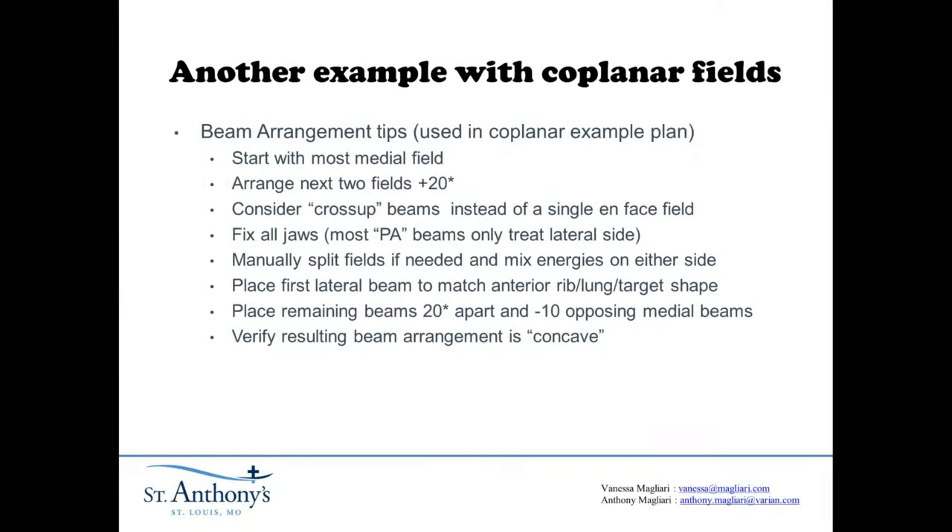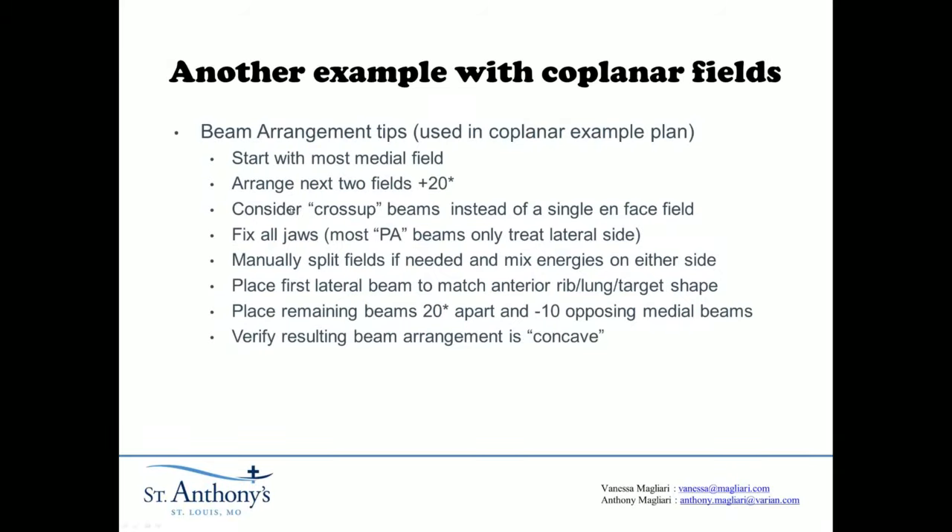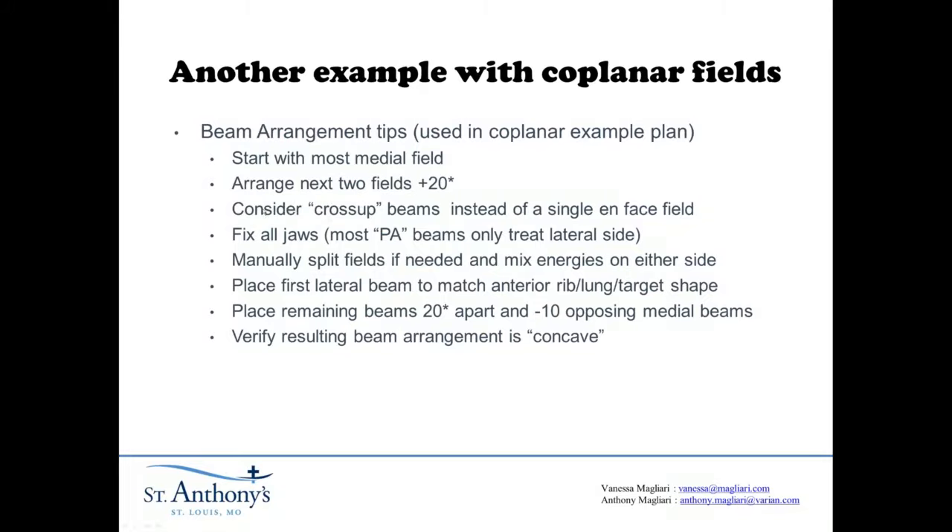I wanted to end by talking about a coplanar beam arrangement and lay out some of my standard tips for making a static field IMRT plan with a coplanar beam arrangement. You're going to start with your most medial field — see exactly how far you can move it over without colliding with the patient and try to utilize it. As a rule of thumb, I try to do my next two fields 20 degrees from that: so if this was 60 degrees from AP, then this one would be 40 and then 20 for the first three fields. Then instead of that non-coplanar field, I do a pair of cross-up beams. Finally, I fix all jaws, and the beams that end up being the most PA will only treat the lateral side — you're not going to try to go across the whole plan to treat the medial portion with your most PA beams.